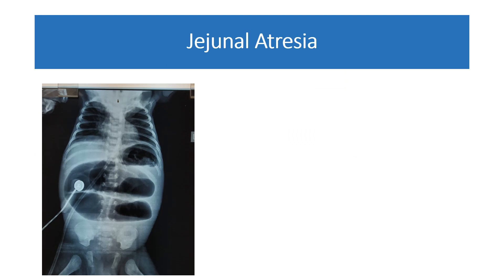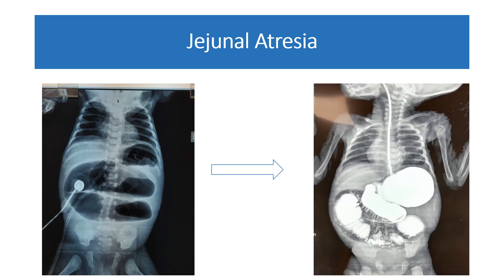For confirmation of jejunal atresia, we can perform a barium meal. In this barium meal, you can see the barium in the nasogastric feeding tube, the stomach, the duodenum, and the jejunum — but beyond this, there is no barium flow visible. The diagnosis is jejunal atresia.